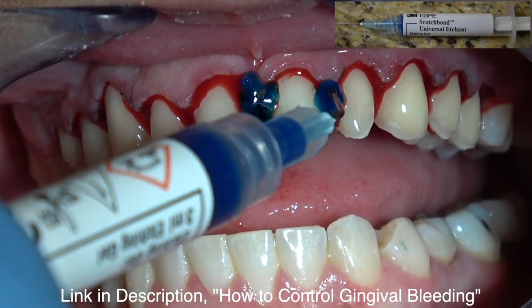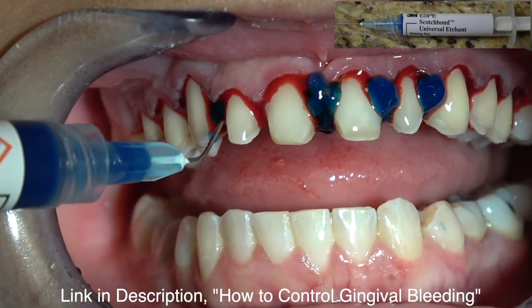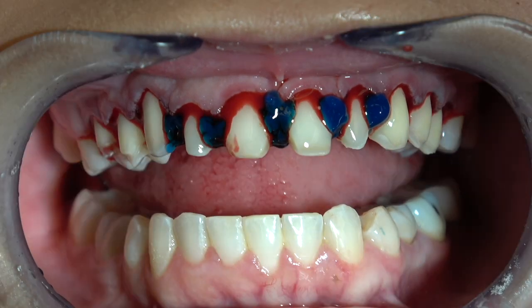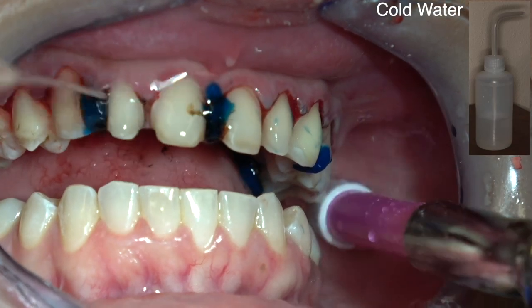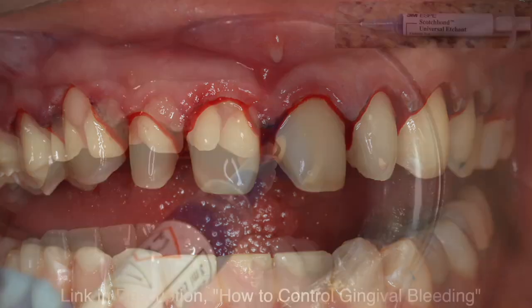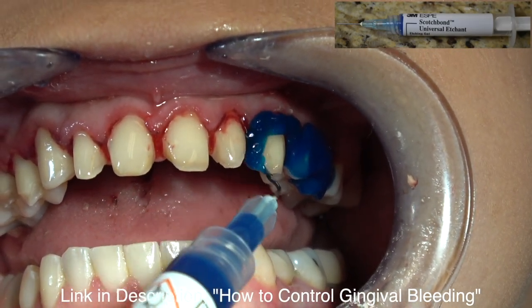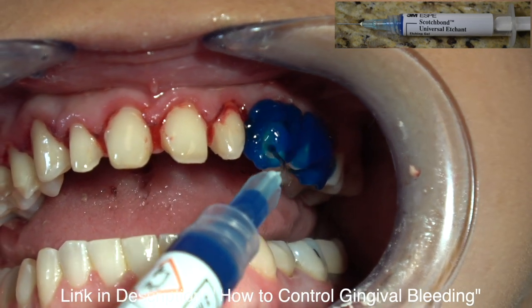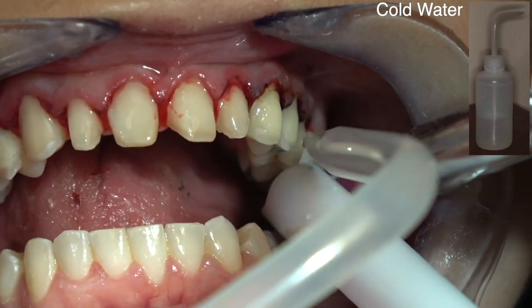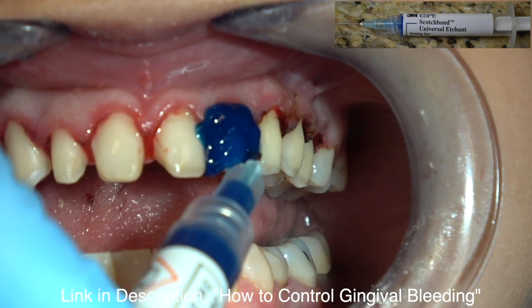If you still have bleeding I'll place it again for 45 seconds — I don't place it for more than 45 seconds to a minute at a time. The objective is I want the bleeding to scab. So it's starting to scab here. I'm etching these teeth with 38% phosphoric acid for 45 seconds on tooth, and I'm also placing it on the gingival tissue to scab the bleeding. You can see the bleeding has really slowed down.